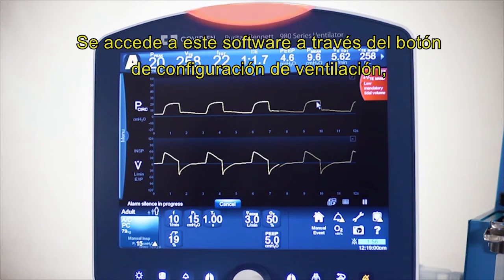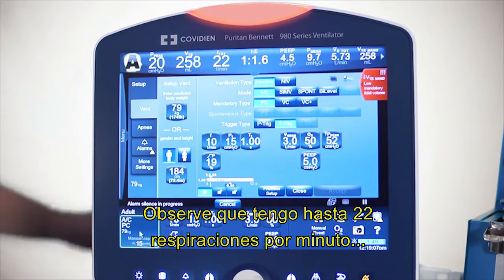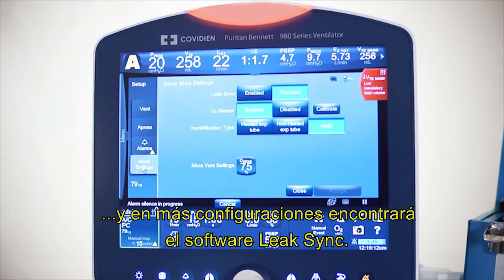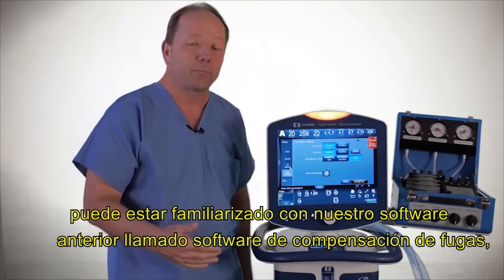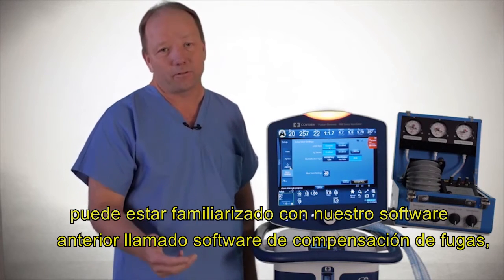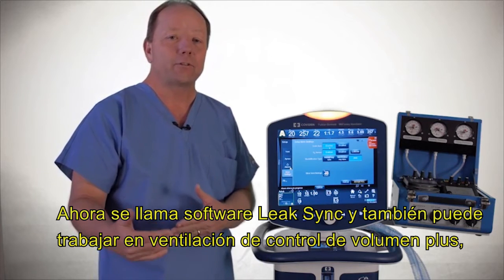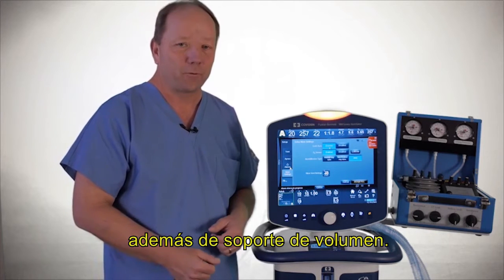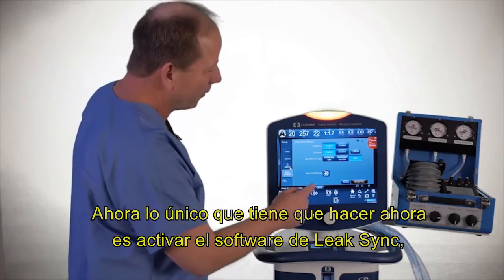So this software basically is accessed through the event setup button, and I'm just going to touch it here. Notice I'm up to 22 breaths per minute. And under more settings, we'll find the leak sync software. Now you may be familiar with our previous software called leak compensation software. It is now called leak sync software, and it also has the additional capability of working in volume control ventilation plus as well as volume support. So all you have to simply do now is turn on the leak sync software.